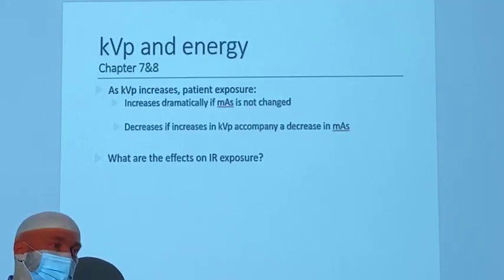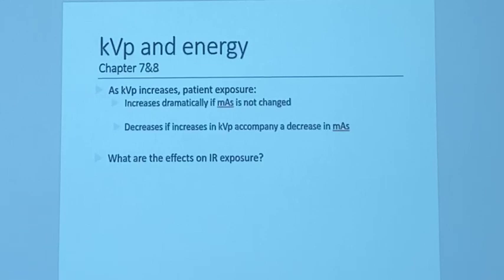So now there's 3 different ways you got to pay attention to this. One is dose to the patient. KVP goes up, and that's all you do.